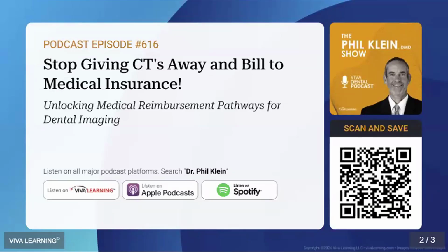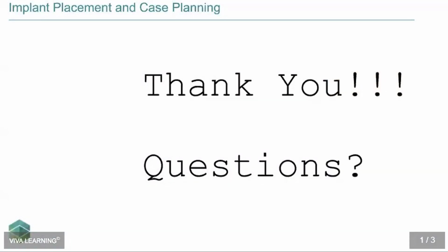Okay, next one. I know we're at 8 o'clock, but is it okay to place an immediate implant after extracting an abscessed tooth? I can tell you, yes, absolutely yes. Like I said, I'm putting in implants in abscessed teeth probably 95% of the time. I almost never have to graft abscessed teeth. And we have great results from that because we treat with antibiotics for at least 10 to 14 days.